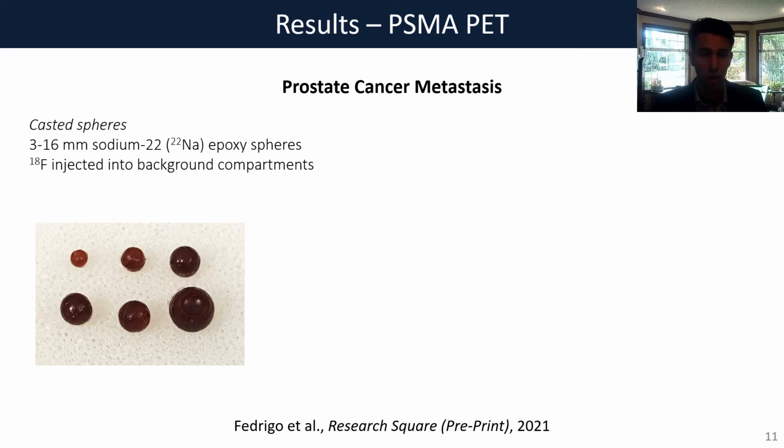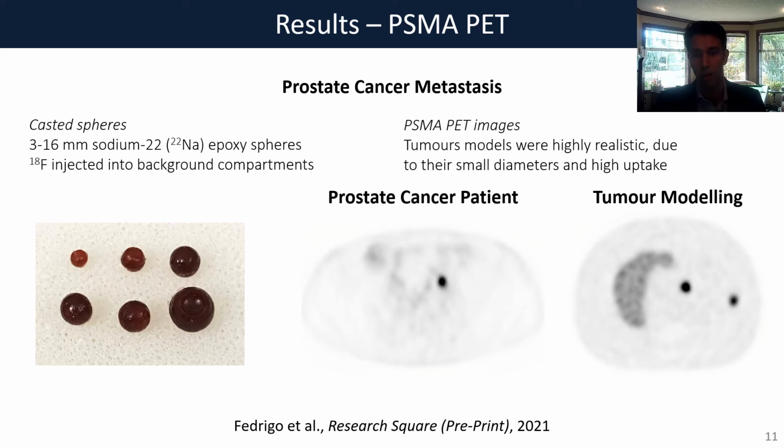And we cast 3 to 16 millimeter epoxy spheres that have been infused with sodium-22, which has similar decay properties to F18, but a much longer half-life, which makes it useful for performing repeated quality control experiments. After inserting these lesions into a phantom, we compared it with a patient scan. And we found that these tumor models were highly realistic due to their small diameters and also really high uptake.